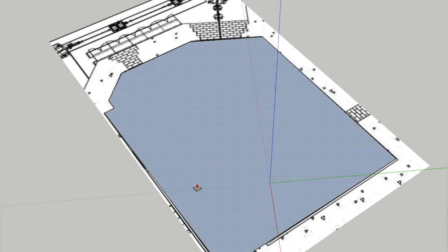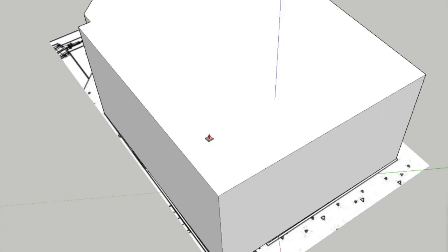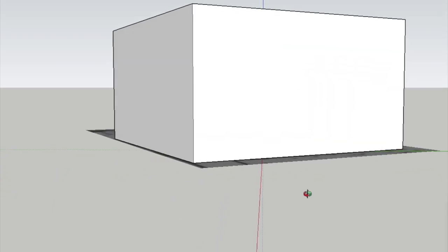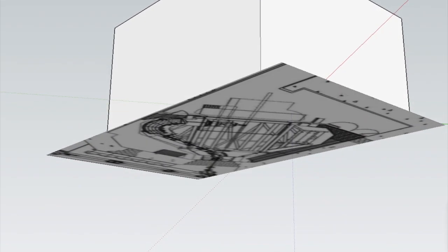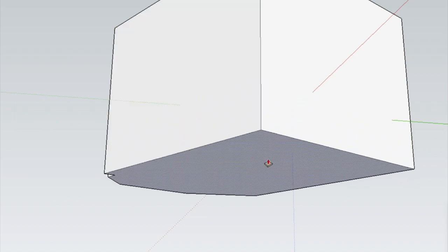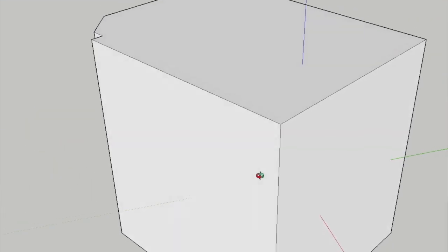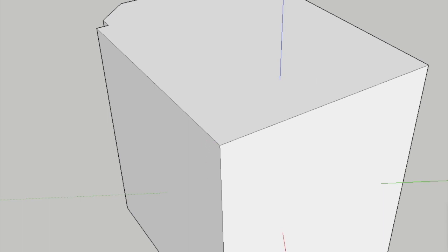Now, in order to rotate the Gantry, we need to pull that volume up by that 20 feet radius that we need to rotate the Gantry and create the free space, and we also need to pull it down by 20 feet from the isocenter to allow the Gantry also to rotate in the bottom half. So we see therefore a 3-dimensional volume now, which is the volume that we need to shield to operate a Gantry.